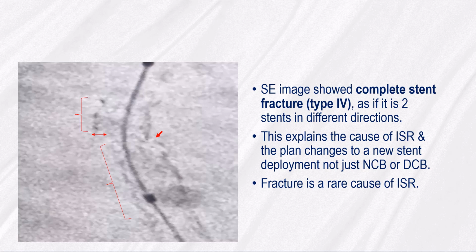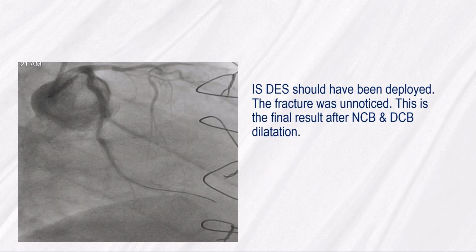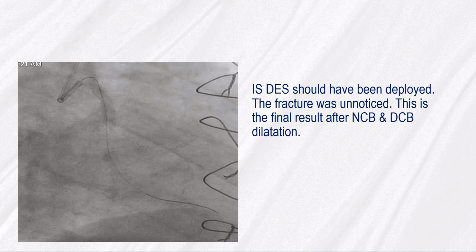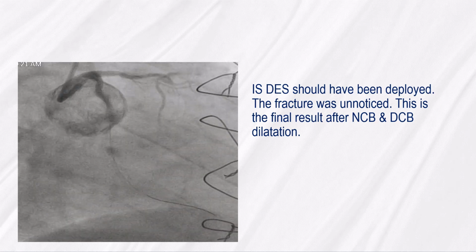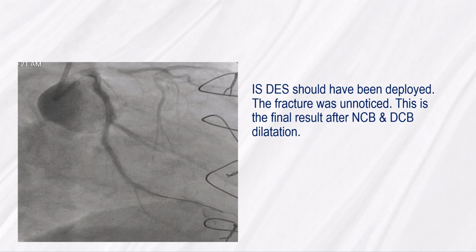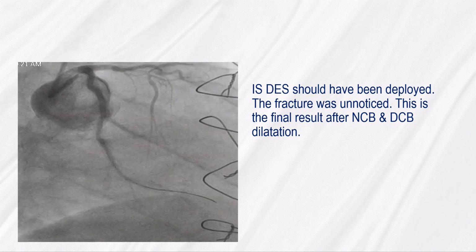different directions. This explains the cause of in-stent restenosis, and the plan changes to a new stent deployment, not just non-compliant or drug-coated balloon. Fracture is a rare cause of in-stent restenosis. And in-stent DES should have been deployed. The fracture was unnoticed. This is the final result after non-compliant and drug-coated balloon dilatation.